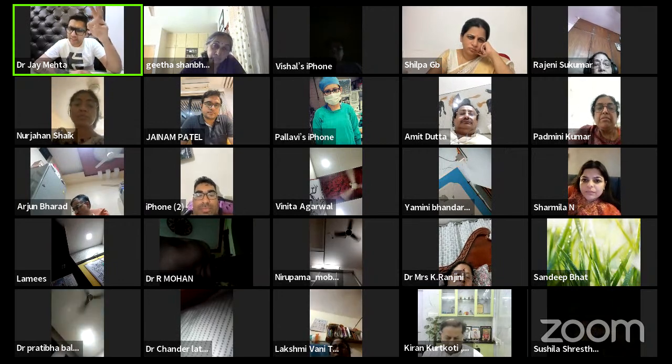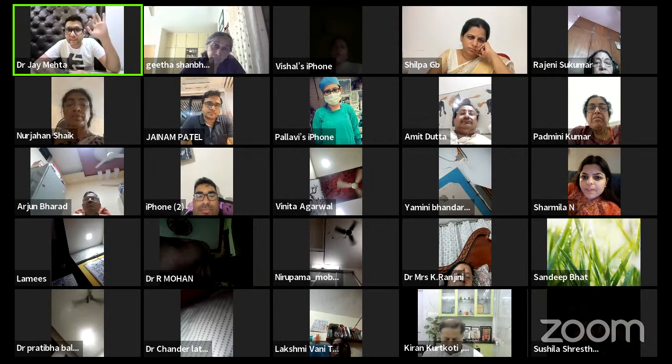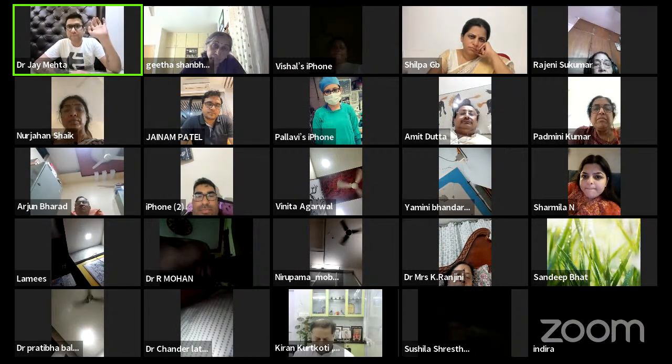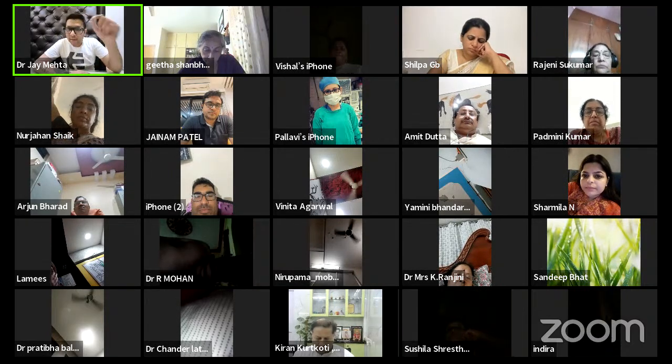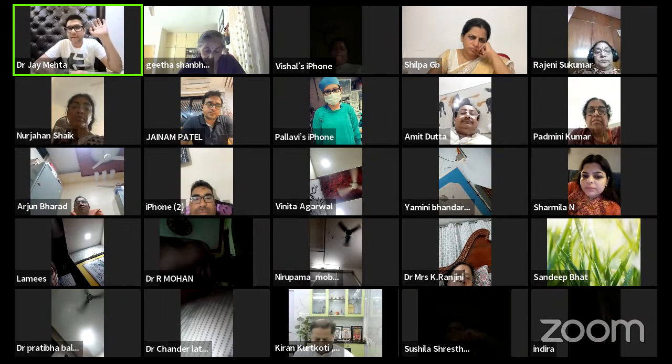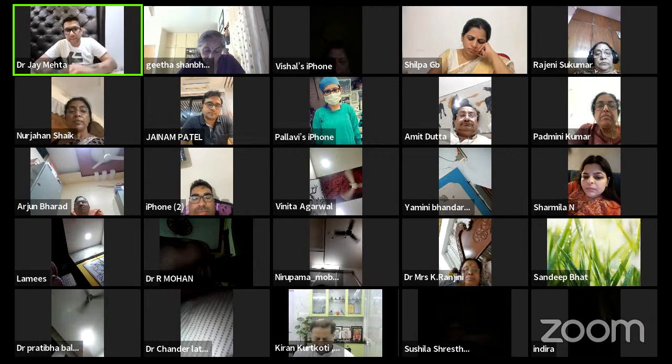You will cut, and what will happen is a very small stalk will remain attached. Rest everything will come out. That small stalk will regrow in the next cycle. So recurrent polyp is due to partial polypectomy. It is an iatrogenic thing. You need to ensure that it is completed.